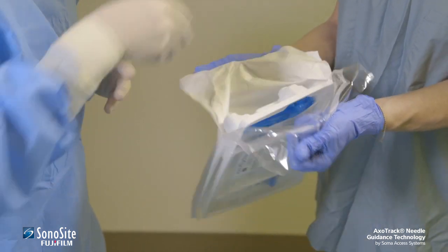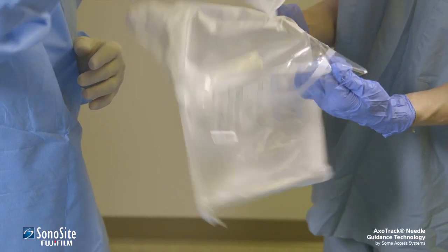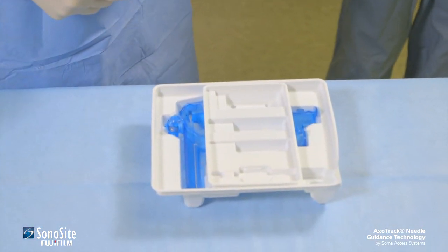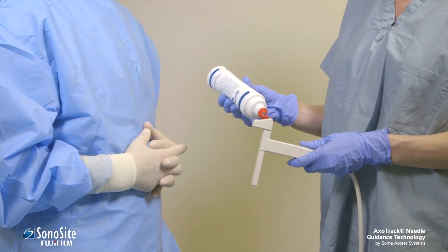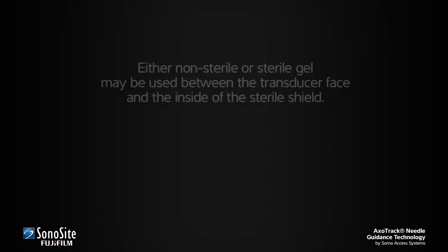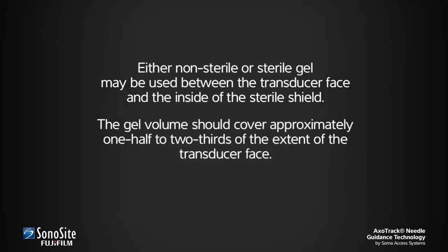The sterile practitioner then removes the sterile kit from the pouch and places it on the sterile field. The assistant applies a pea-sized volume of ultrasound gel to the transducer face. Note that either non-sterile or sterile gel may be used between the transducer face and the inside of the sterile shield. The gel volume should cover approximately one-half to two-thirds of the extent of the transducer face.